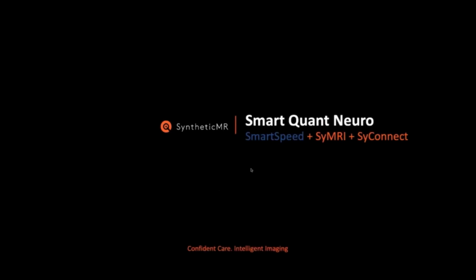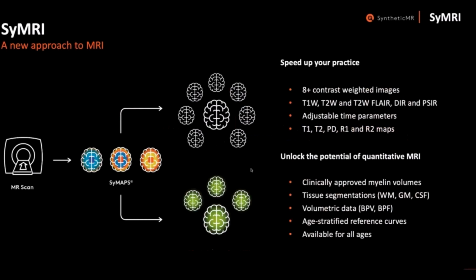So SyMRI gets input from a single proprietary MDME scan. Dr. Savatovsky will provide a bit more details on it later on.